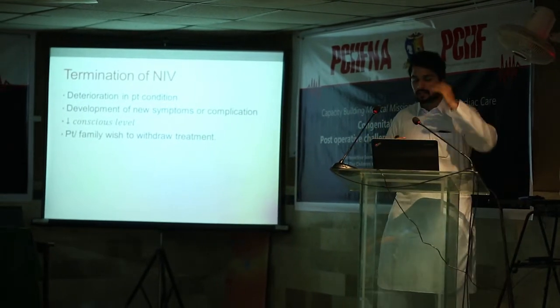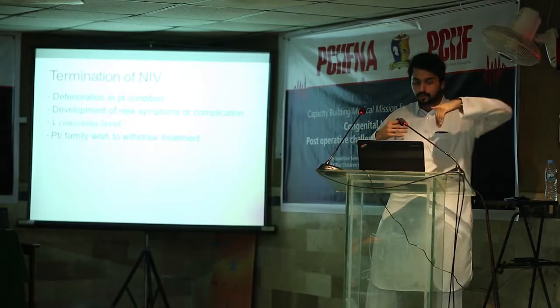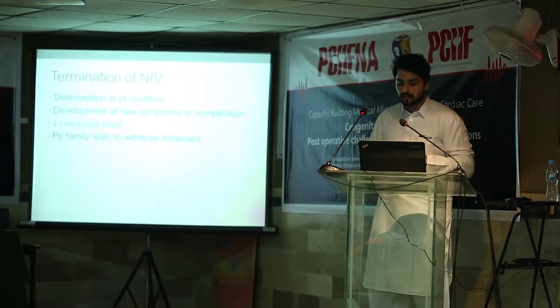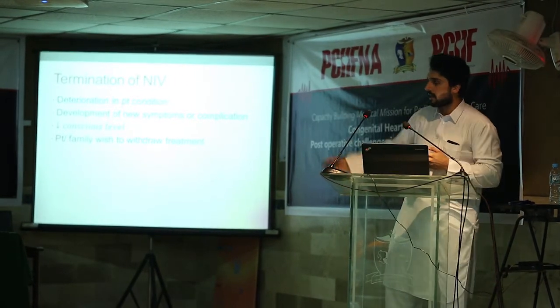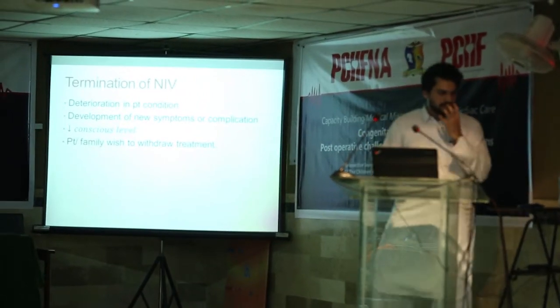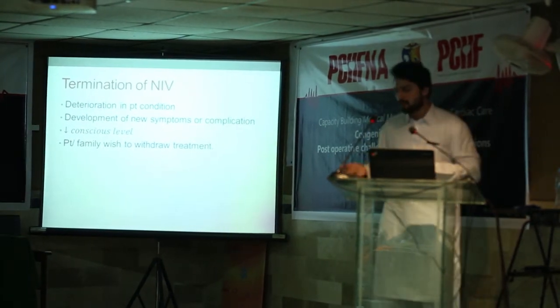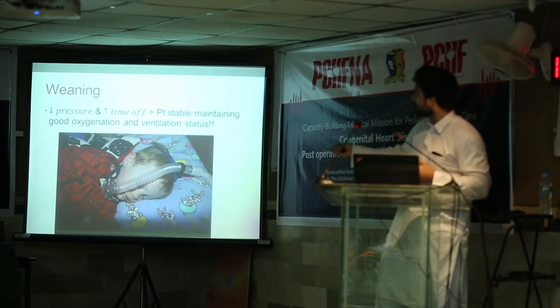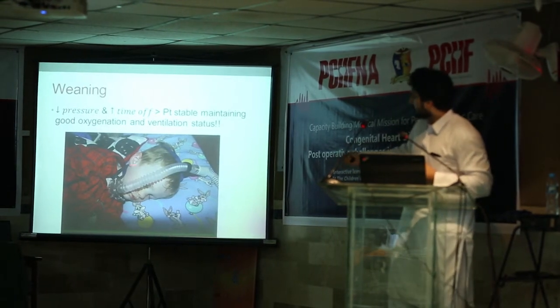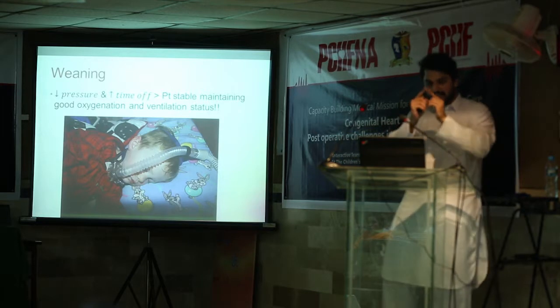So for example, as I said, the BP. After applying the NIV, the BP dropped very low. We just have to stop it, terminate it, or support the BP. Sometimes the family sees the patient suffering and says, no, let's remove it. So we have to terminate. Weaning. As we see here, the very simple technique for weaning is to reduce the pressure and increase time off.